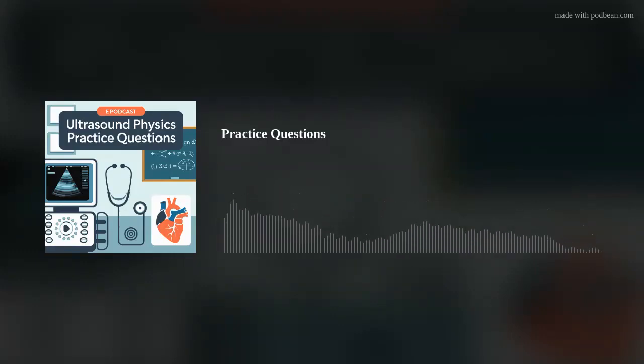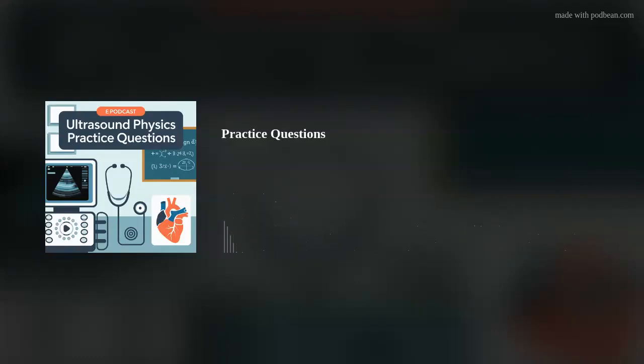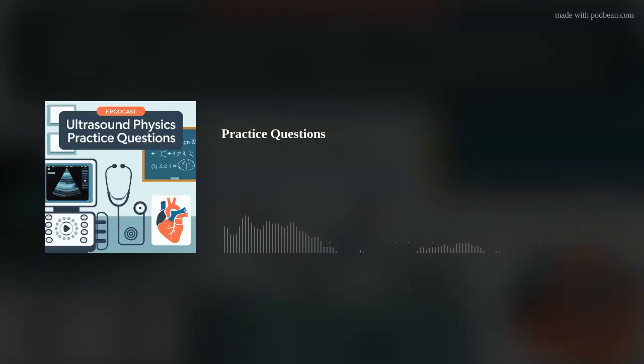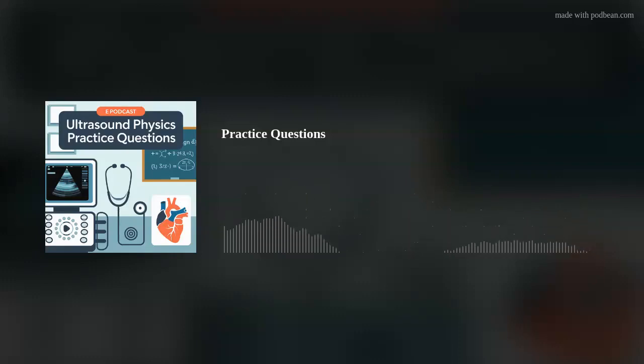The next part in the practice materials is all about transducers. I see phased arrays, annular arrays. To be honest, it's a little overwhelming. Think of transducers as the heart of the whole system, right? They're what send out and then pick up those sound waves we were talking about. They change electrical energy into sound and then back again. It's like they're both the microphone and the speaker. There are different types of transducers, each with its own pros and cons, but the ones to really know for your exam are phased array transducers.